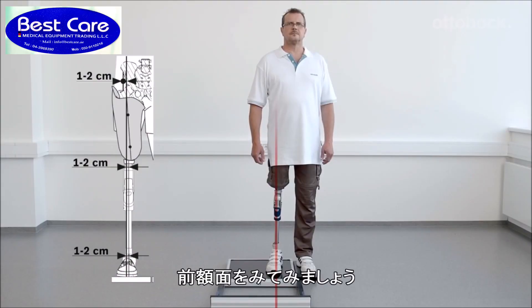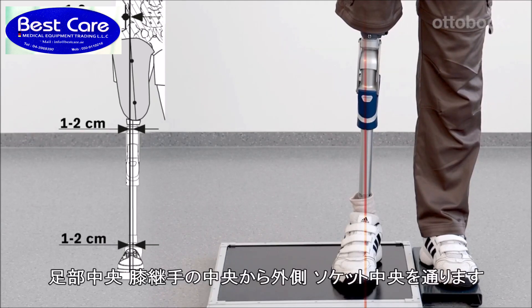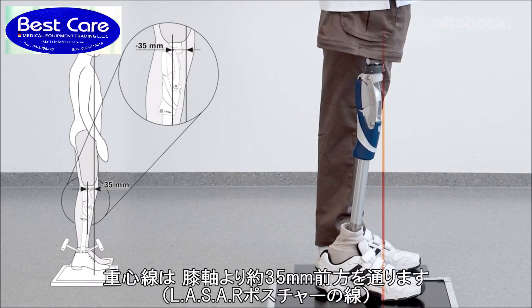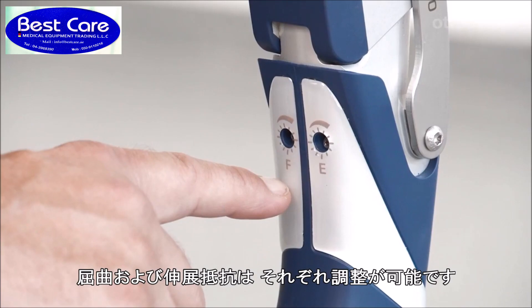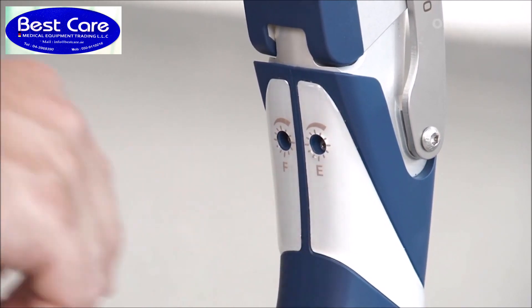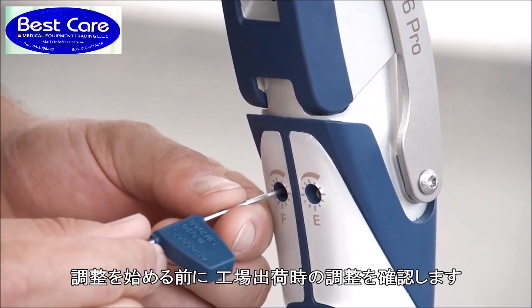Looking at the frontal view of the knee, the alignment reference line runs through the middle of the prosthetic foot, middle to outer edge of the knee, and middle of the socket. The sagittal plane alignment should be adjusted solely by changing plantar flexion so that the load line runs about 35 millimeters in front of the anterior upper knee axis.